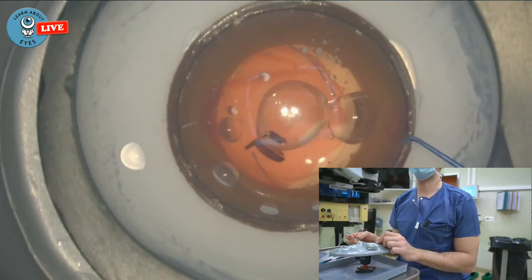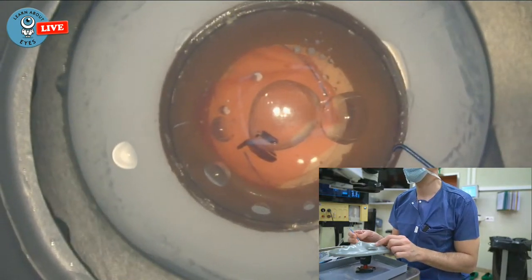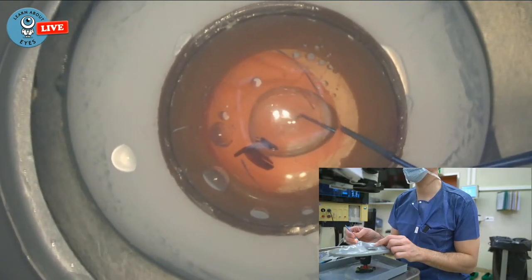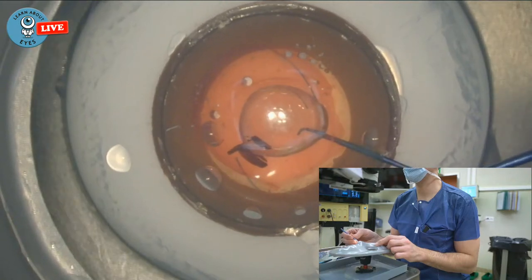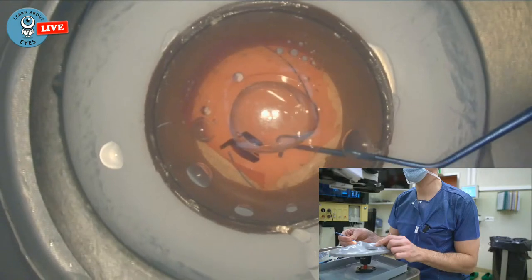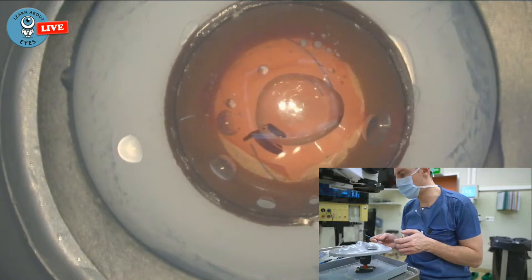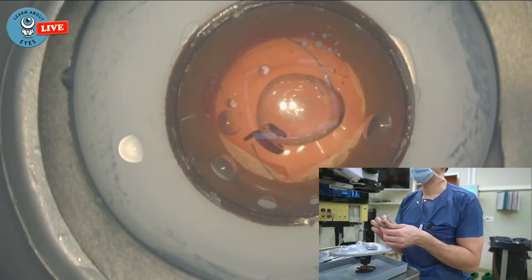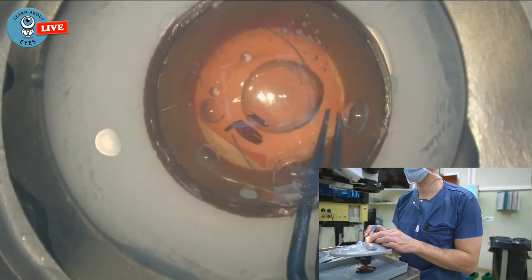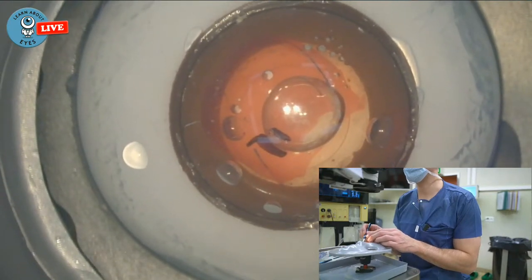Sucks, I've just got those bubbles that are in the way. And gotta deal with it. Just trying to get this back from behind. So it's nice. Well covered. Maybe I can use a little forceps to pull. Hope I don't tear it. Nah, that wasn't a good idea.